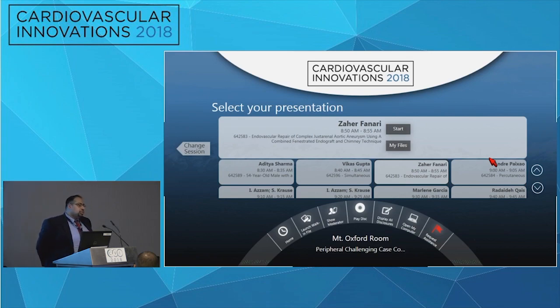The problem with this as well is, you get the CT scan, you ask for the fenestrated graft, which takes like 4 to 6 weeks to be done. That's part of why it took longer, and it probably grew a little bit more. We discussed it with the patient, explaining that if we don't do anything, this is growing really fast, and there's a very high chance you're going to die. But this is a very high-risk procedure. If we occlude the SMA and we're not able to open it up, then you may die from bowel ischemia. And we were very clear with that.